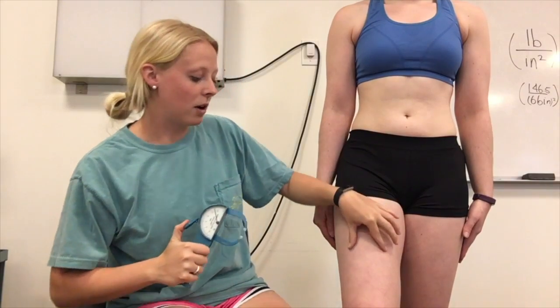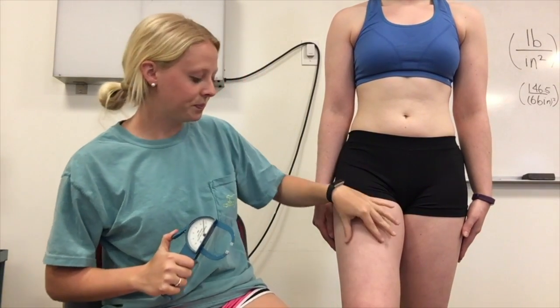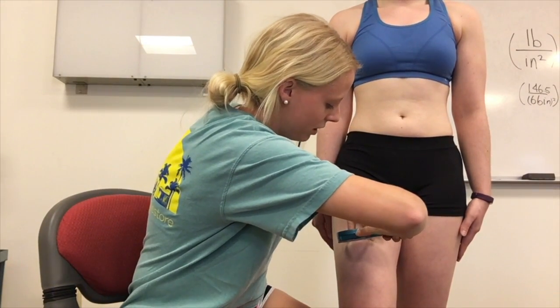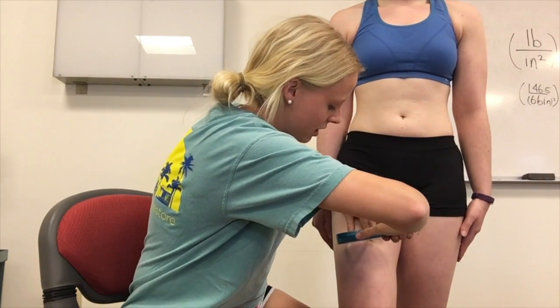As the test administrator, my primary responsibility is to place the jaws of the skin caliper onto the skinfold of the site and release them slowly — because it can be uncomfortable — and hold for one to two seconds, which is the ACSM recommended guideline. I grab the skin with my pointer finger and thumb, place the caliper over it, count one-two, read the number, and record the data.